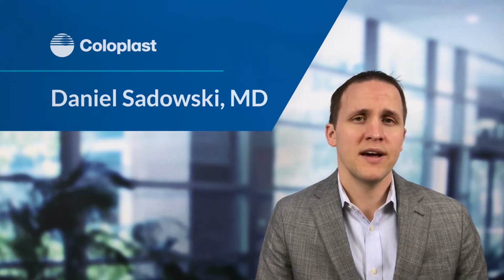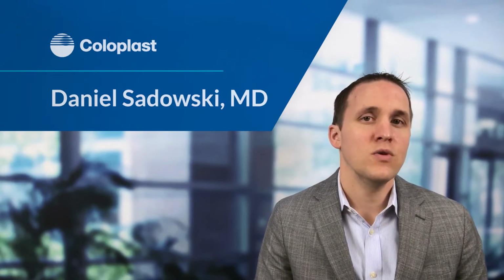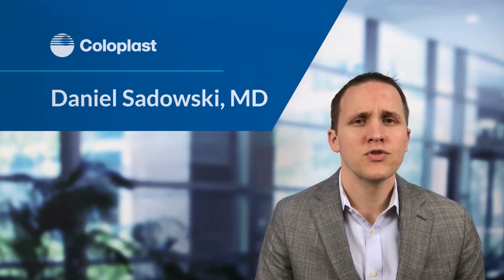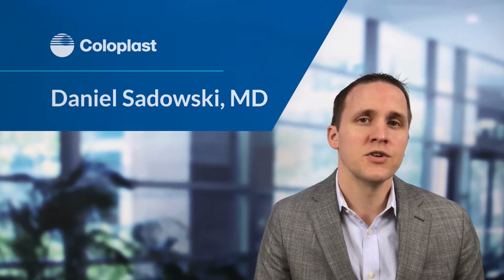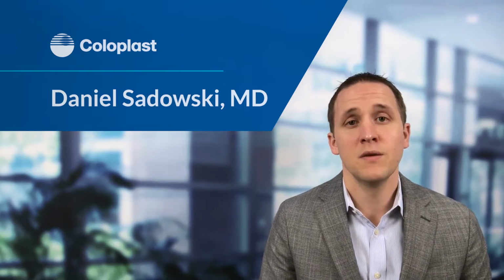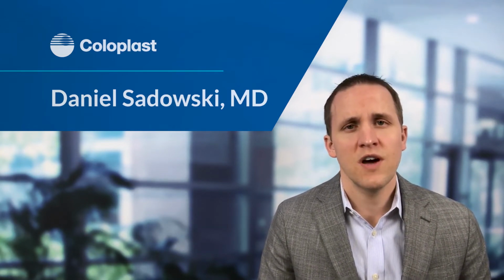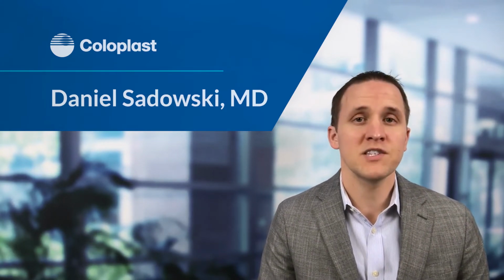The inflatable penile prosthesis provides a more natural erection in that you can pump it up, and there's a pump that would be located in the scrotum, and then the cylinders are in the penis. When you use the pump, it puts fluid into the cylinders to create the erection. Utilize it for sexual activity, and then when you're done, you can deflate it, and then the penis goes to a soft state and a more natural appearance of a flaccid penis.